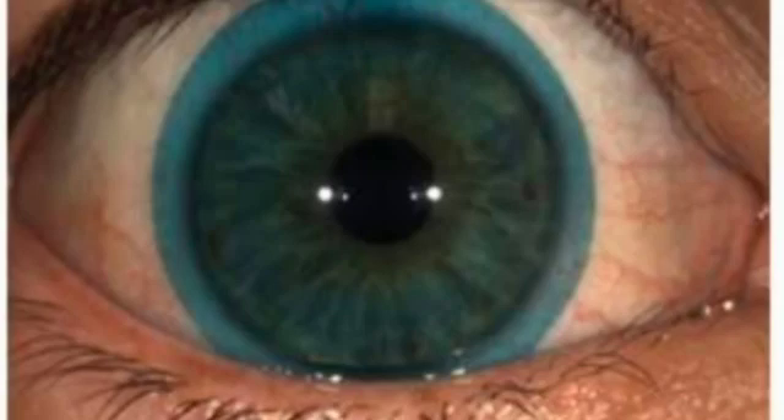Next, check for contact lens coverage. The contact lens should cover 1 mm around the cornea in all clock positions, and the ideal movement should be 0.2 mm. For contact lens removal, use the middle finger of your left hand to hold the upper lid and the middle finger of your right hand to hold the lower lid, then pinch the lens.